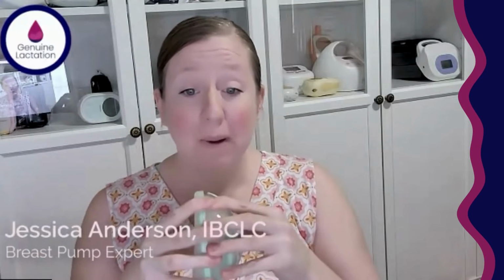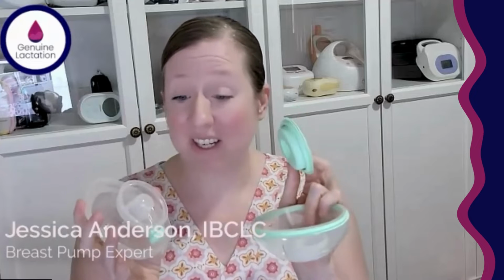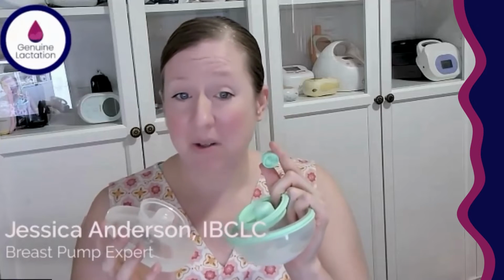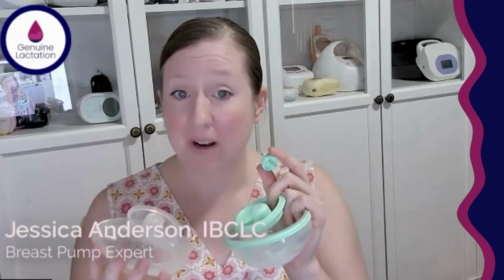So let me go ahead. I'm going to pull this tubing off this cup so I can take this one apart. So this cup is unique in that it is extremely leak free. Up here is a tiny little air hole, and that is the only source of air exchange for these cups. They are pressed together on a seal. You can see they actually get pretty good suction. You've got a diaphragm in here that will need to be replaced about every 90 days. This is going to need to be replaced a lot sooner. Typically, they last about 3 to 4 weeks.